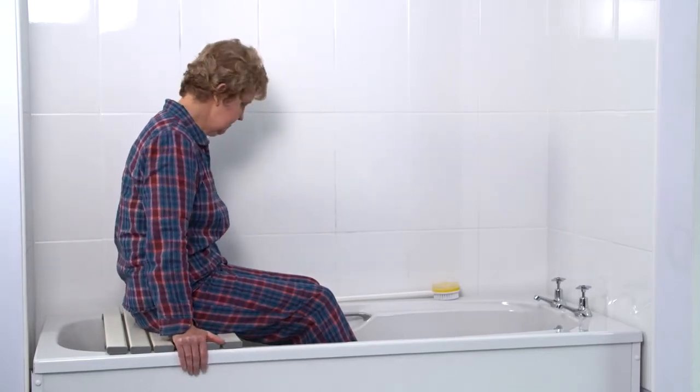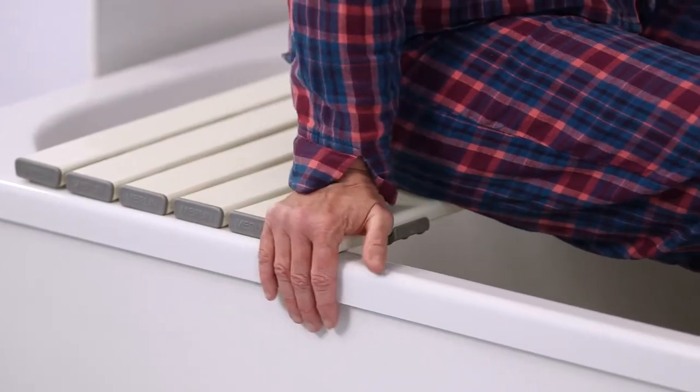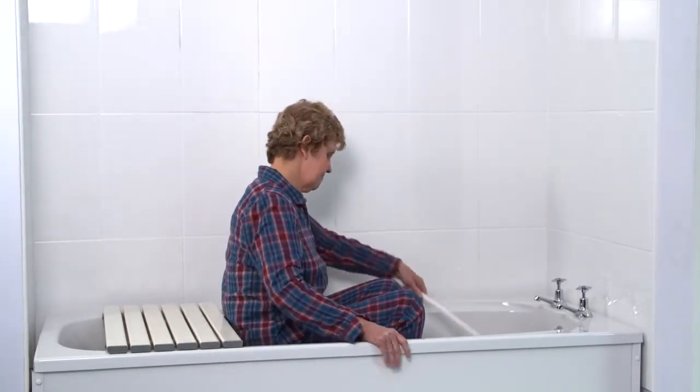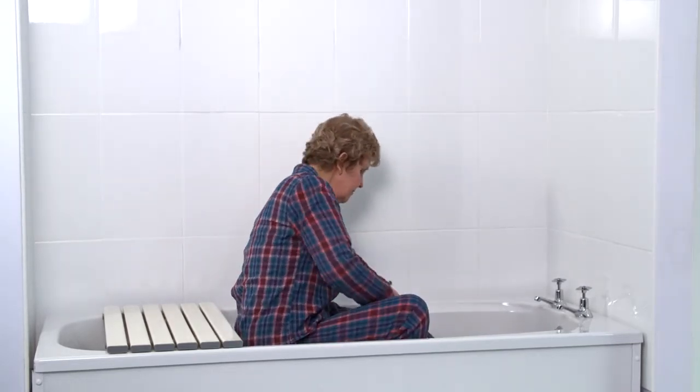To move from the bath board to the bath seat, place your hands either side of you on the bath board. Lean forward slightly, push through your hands and your legs to lift your bottom from the bath board and lower it onto the bath seat. You can have a wash sitting in this position.